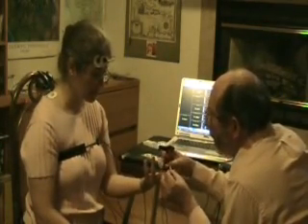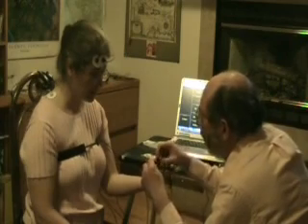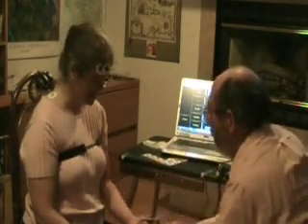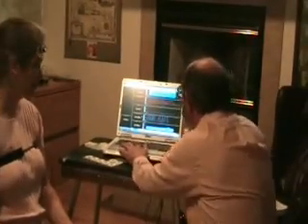And just as with the other sensors, your job is to tell me whether they start getting cold and turn blue and all that, all right? Okay. It can't be too tight. Okay. So now what we want to do is check to see if the thermistor, the temperature probe, is working.